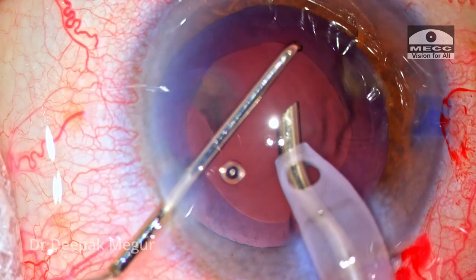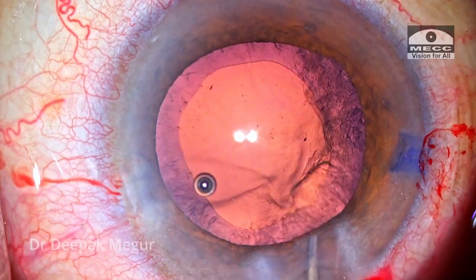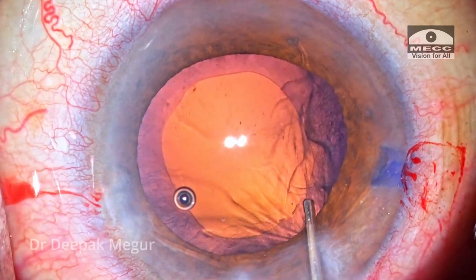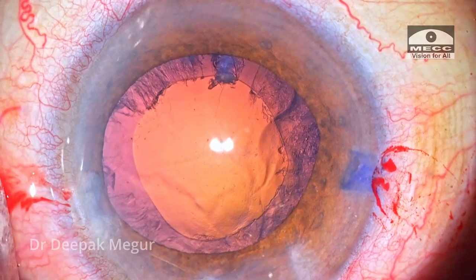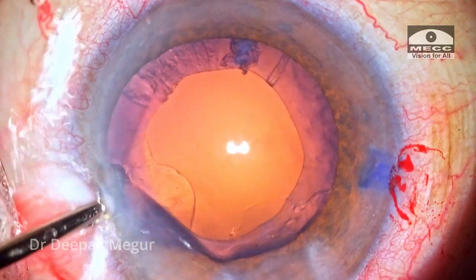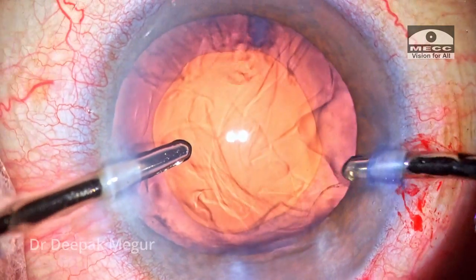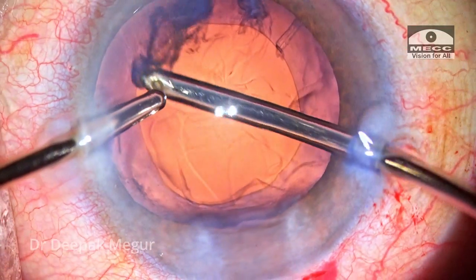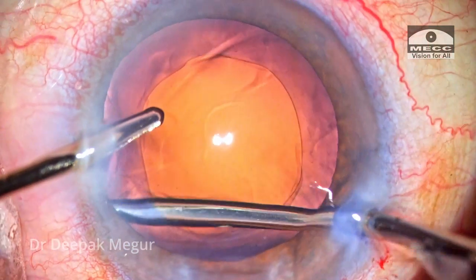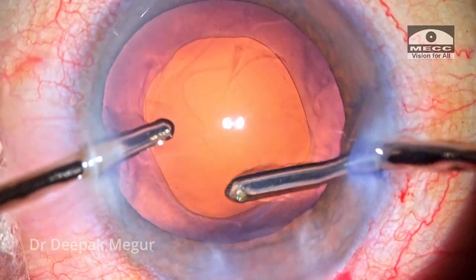The last nuclear fragment is emulsified. Time to deal with the cortex. The posterior capsule is flushed with BSS gently to loosen cortex that might be sticking to it. A tiny fragment stuck at the side port is noticed when we introduce the irrigation handpiece, and is gently expressed out to the main wound. It's important to watch these side port areas where tiny lens fibers or fragments could be sticking — these can be a reason for chronic low-grade post-operative uveitis. So please keep a watch on these side ports, as some lens fibers could be hiding.